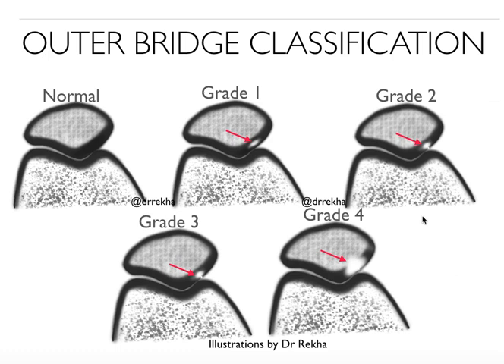Thank you Dr. Rekha for the excellent illustrations of chondromalacia patella. This is a normal cartilage — grade 0 — because radiologically we don't see any abnormality. Sometimes on arthroscopy there might be fibrillations which are not visible on 1.5 Tesla MRI, whereas these fibrillations may be appreciable on 3 Tesla and 7 Tesla MR scanners.